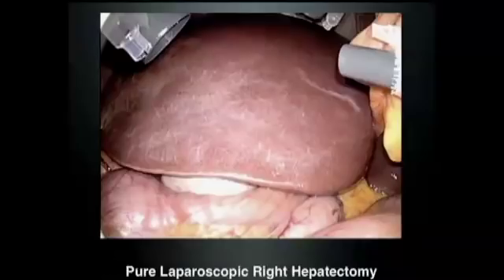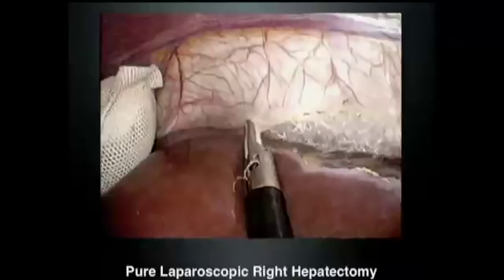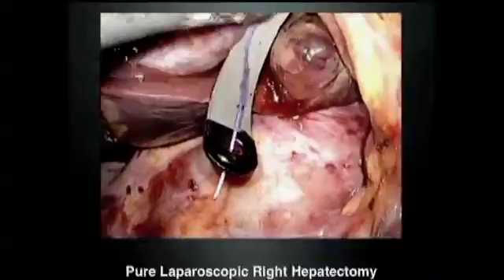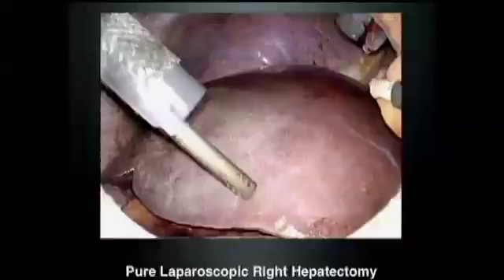This is a typical pure laparoscopic right hepatectomy. Short hepatic veins are closed, clipped, and divided. Full mobilization of the right side is performed using an ultrasonic coagulator and bipolar forceps and bipolar coagulator. We always apply right portal pedicle ligation before starting parenchyma transection. This is also a good device to encircle the hepatic hilum only to the right side and ligate it. Then we see a demarcation line along the Cantlie line.